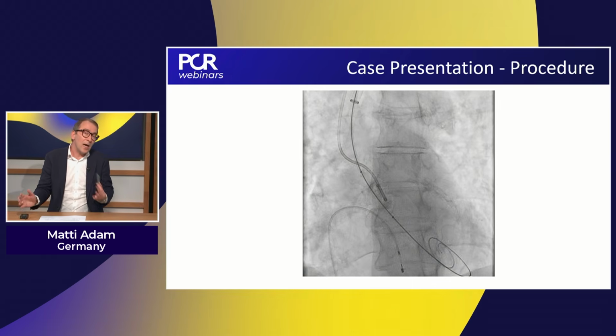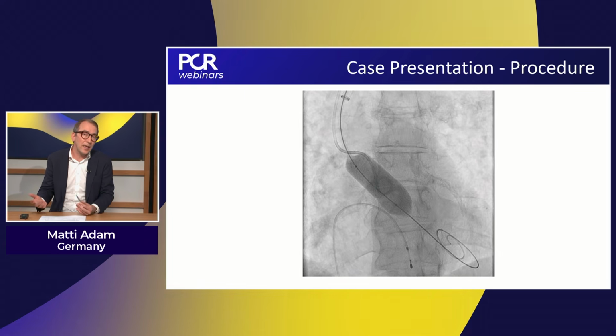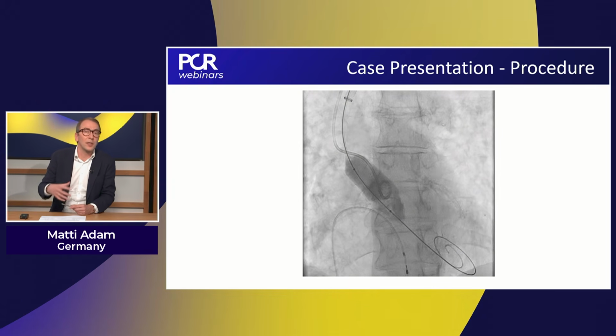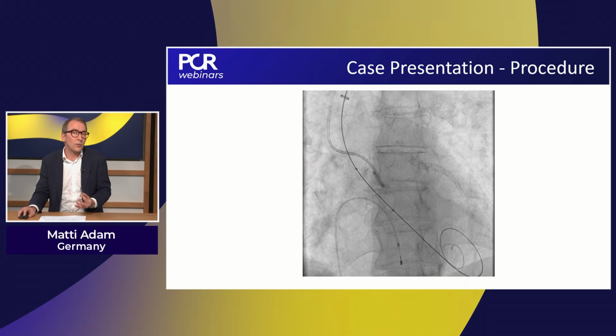So after we established access, you see there's a sheath in place, the balloon comes in, pre-dilatation, and you see the hourglass phenomenon. I think there was really a lot of calcium, but the balloon expanded very, very nicely. So I think that's a good pre-dil.